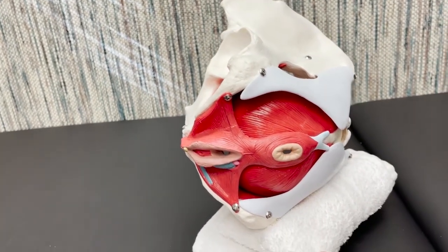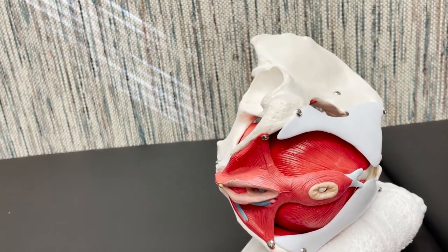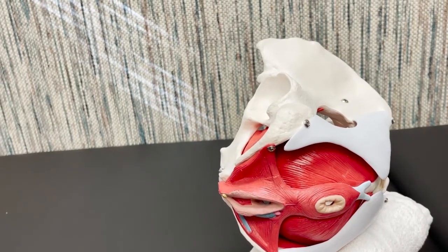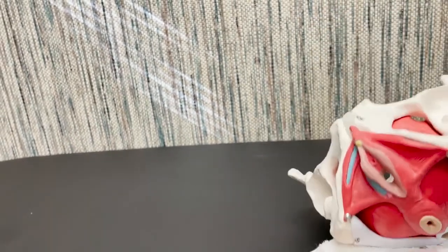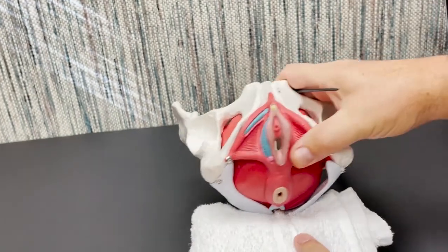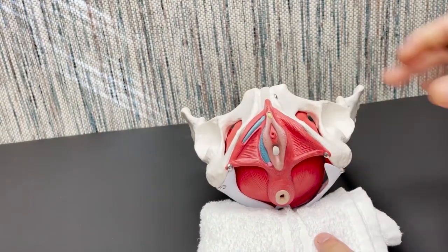So here again, supine, our needle length here is going to be 1 centimeter or less. There's no backdrop here. We're going to have our patient use a towel, and actually we're going to be in the supine position. The bulbospongiosus is one of the only muscles we really have to do this in the supine position. So keep that in mind.